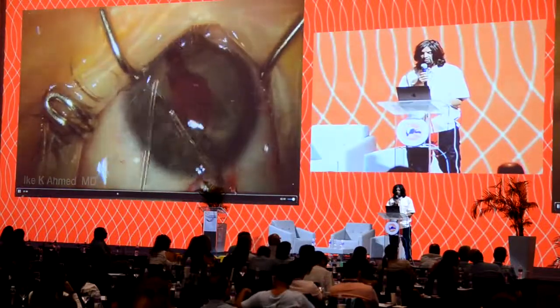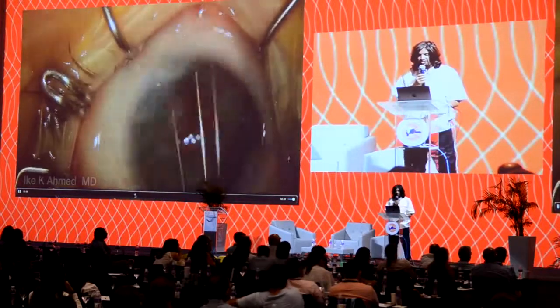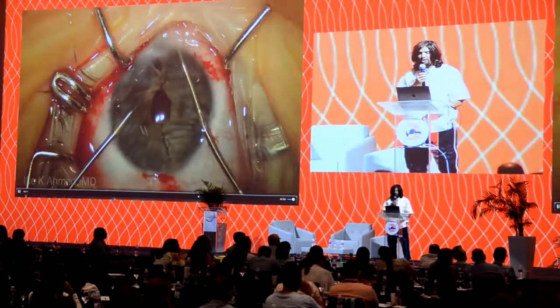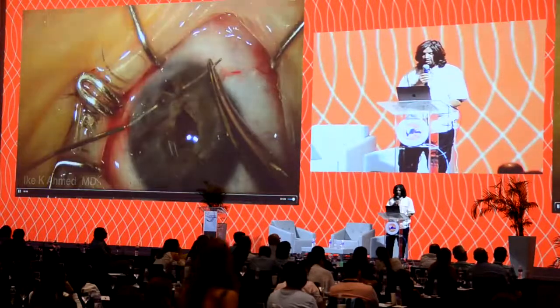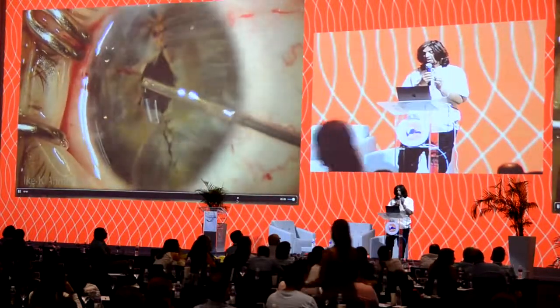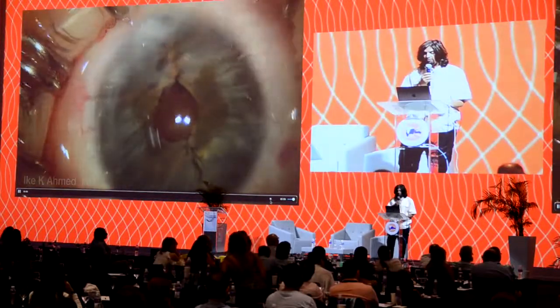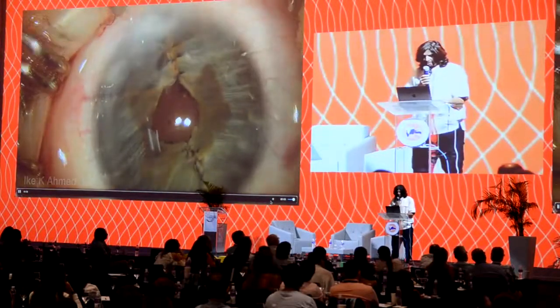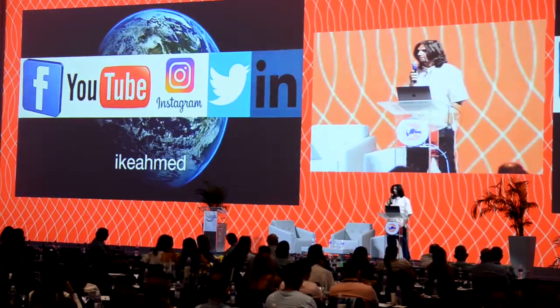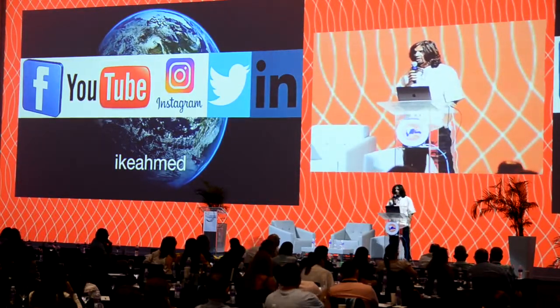Multiple passes here to bring the temporal iris together, releasing the synechia from the cornea without causing a cyclodialysis detachment. Suturing the defect again, multiple passes, suturing in the eye as I showed earlier. And then using more cautery to get the pupil arranged, a little bit of vitrectomy to remove some of the iris here. And there we have the end of the case. We have a pupil that's reasonably centered as well. So those are some cases of manipulating the iris, suturing, cauterizing, stretching, all great techniques.